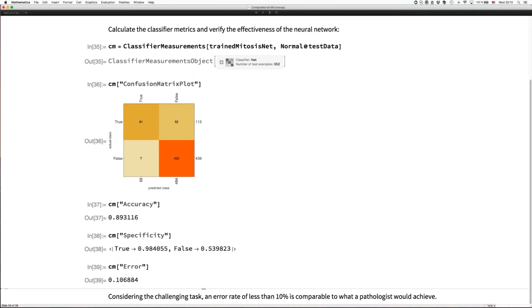So estimating on their performance and how often they agreed on what they were marking as ground truth or not, you can estimate that 10% is a very reasonable value and comparable to what a pathologist may achieve by themselves. So this is in a way a success, even though it looks somewhat mediocre. It's not as shiny, but this is a real-world example. This is what you can actually achieve out there.